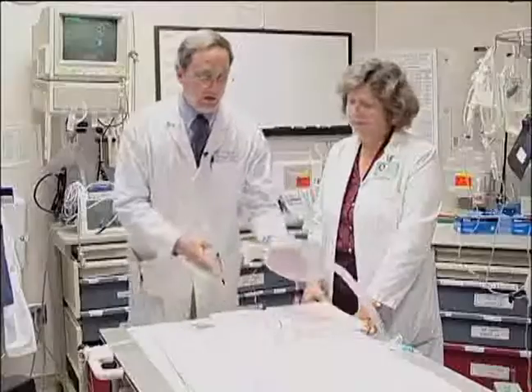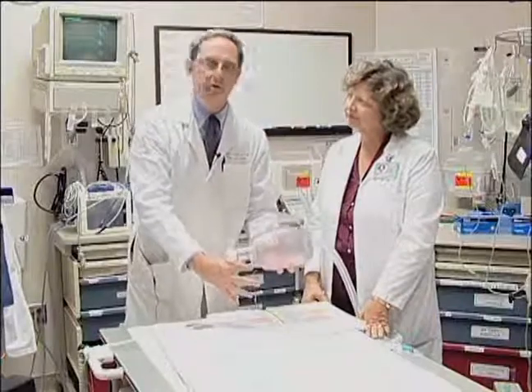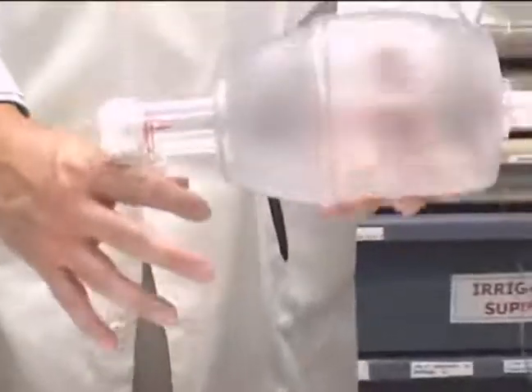That's your job. At the point in which the drugs are given and the patient finally becomes completely paralyzed, let's say we give them a dose of succinylcholine plus some sedative to relax them. Now we begin to actually take over their ventilation, and so the patient will lose their spontaneous respirations, and now we need to make sure we have an adequate seal and we're getting actual breaths, and we see the chest rise, because for these few moments until we actually start the intubation, you're controlling and we're controlling this.